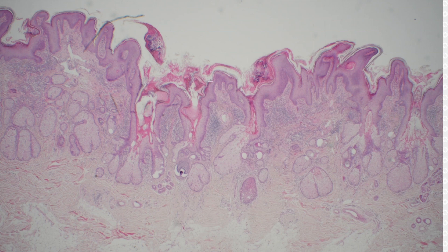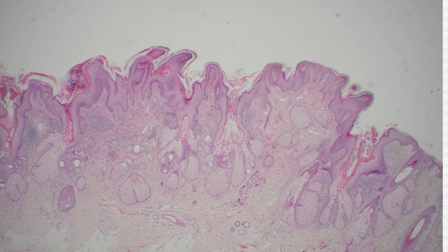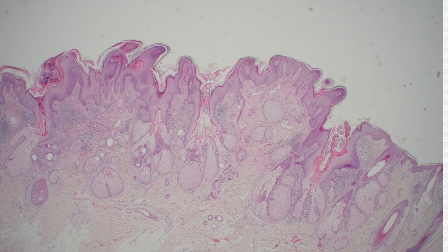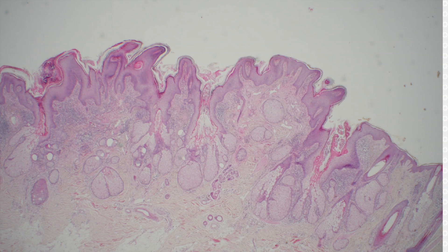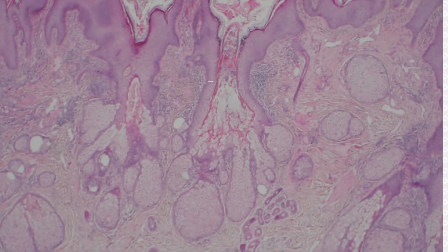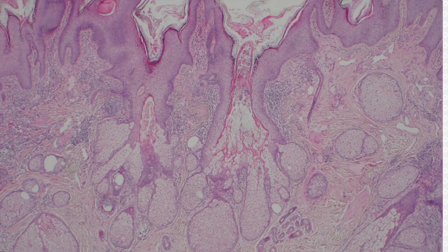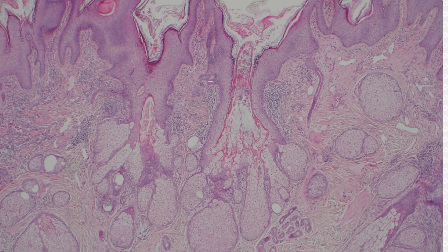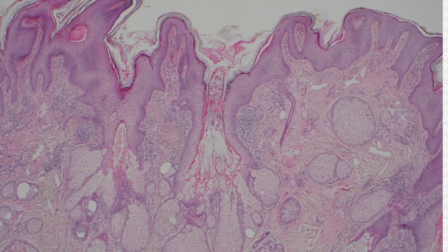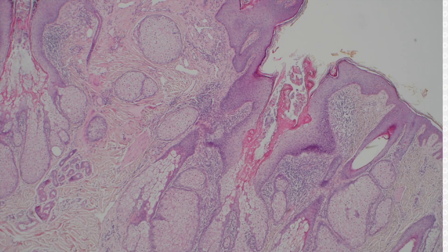Number three. This looks like nevus sebaceous — yeah, it's as classic as you can get. The epidermis is acanthotic and in my view it looks kind of like a seborrheic keratosis or verruca on the surface, and then if your patient is in puberty or later they'll usually have these big sebaceous glands that are mature and that open — unlike normal sebaceous glands which open into follicles — these sebaceous glands open directly to the surface of the skin, which is abnormal. And that's a perfect example you can see right there.